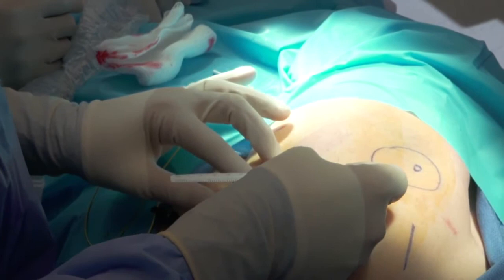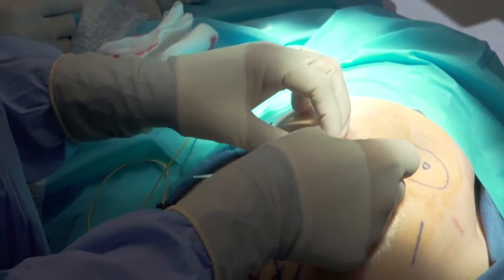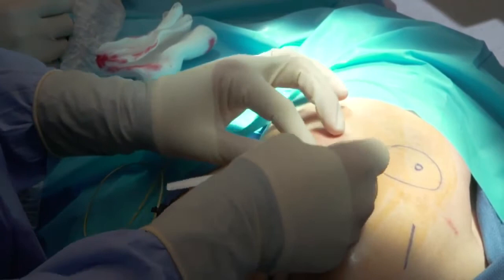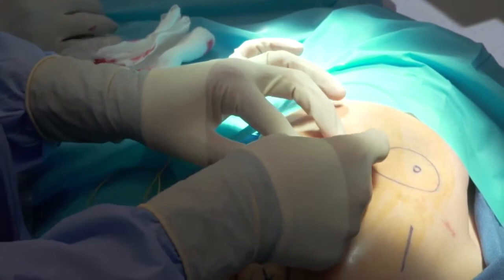Keep in mind what the other anatomical issues your patient has, because that will affect how easy it is for them to put the pads on, and how easy it is for them to utilize the machine. At the end of the day, it could be the greatest modality, but if it's annoying or difficult to utilize from a practical standpoint, they're not going to utilize it. So it's really important at this point of the procedure to think about some of that.